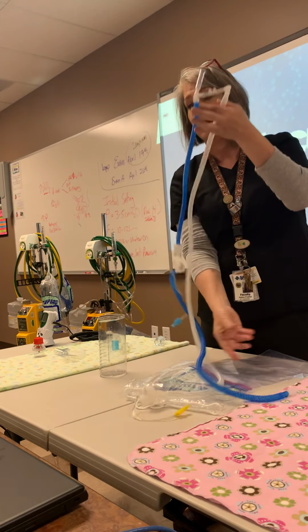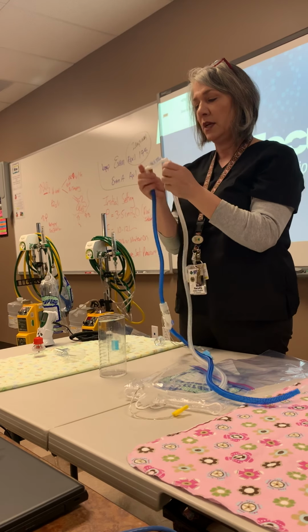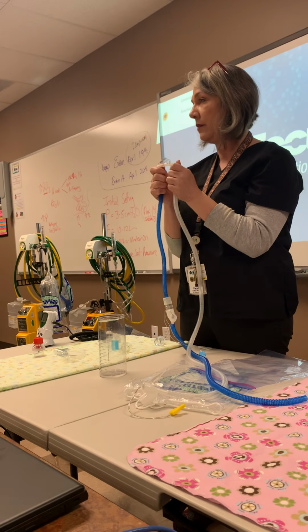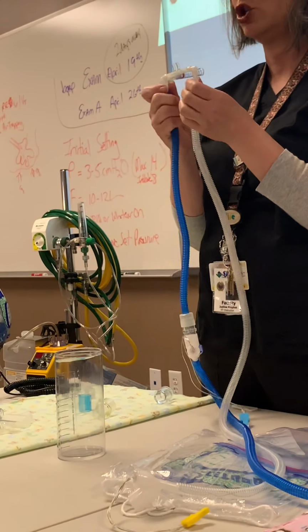Next is your nasal or your nares prongs. On this particular one, here's your nares prongs. This is a pretty good size nares prong, probably easily a 4 kilogram, 5 kilogram baby's prongs. These are really, really large.